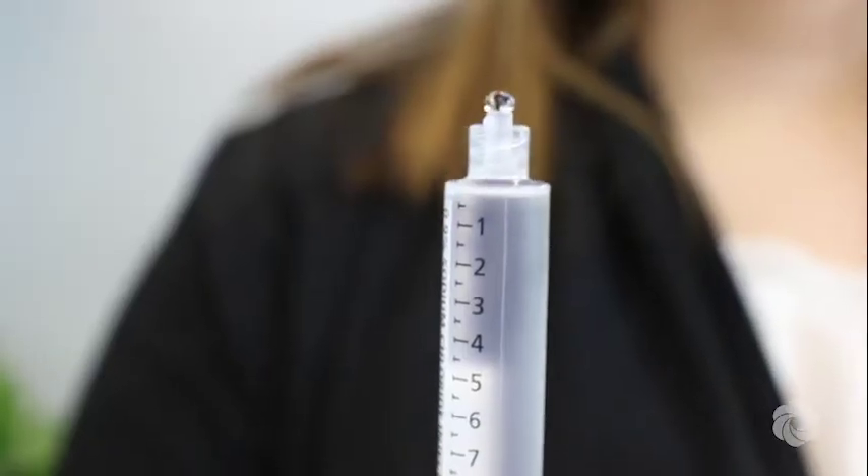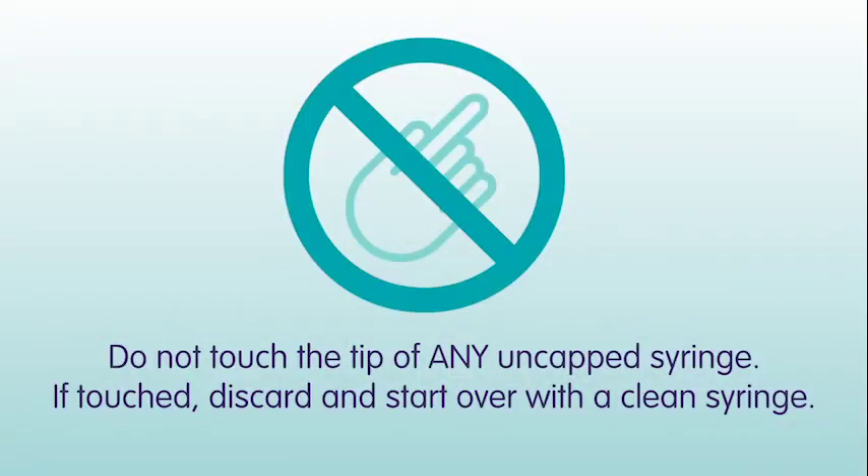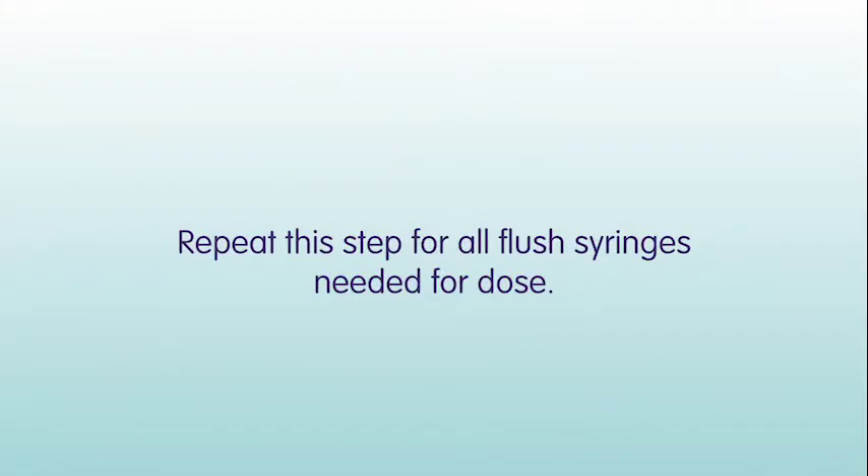Push out extra solution to the amount instructed by your nurse. Finally, replace the syringe cap, being careful not to touch the tip of the syringe with your hand. If you touch it, you will need to start over with a clean syringe. Set aside the syringes until you are ready to use them. Repeat this step for all flush syringes needed for the dose.